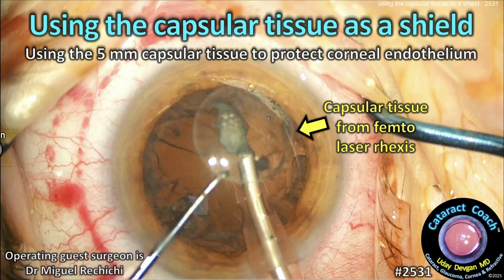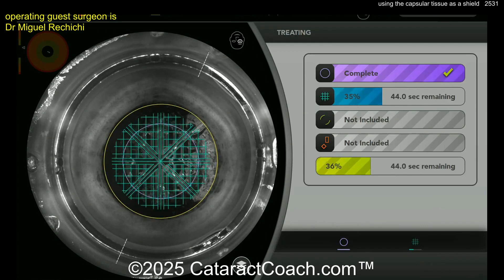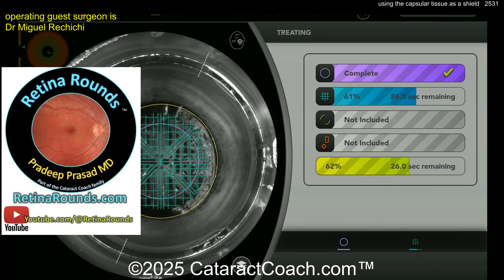CataractCoach.com — using the capsular tissue as a shield to protect the corneal endothelium. This is something I've never seen before. Our operating surgeon is using a femtosecond laser to create nucleus division and softening of the nucleus, but also to create a capsulotomy. That capsulotomy is about five millimeters in diameter, and the surgeon is going to leave that in the eye and use it as a shield.